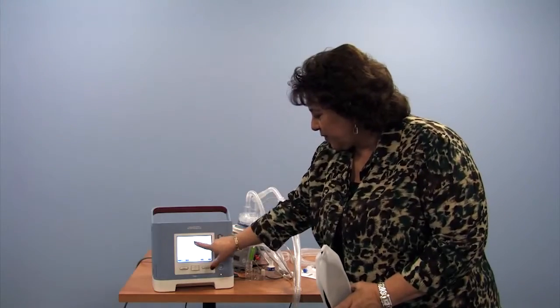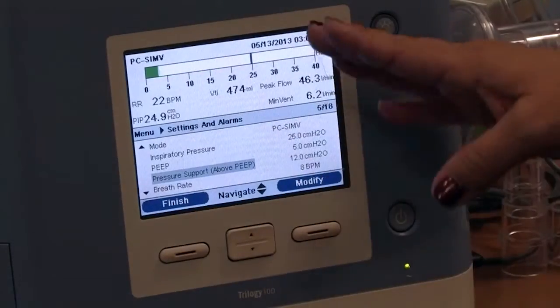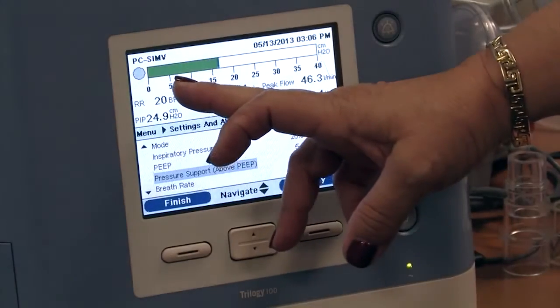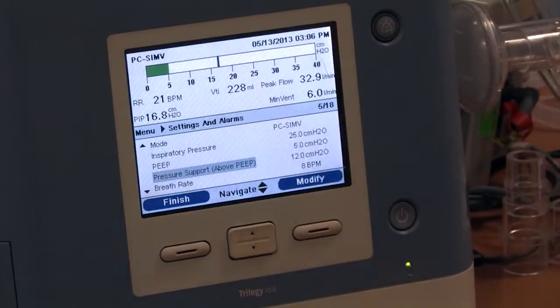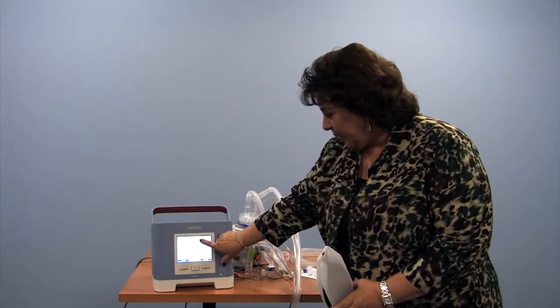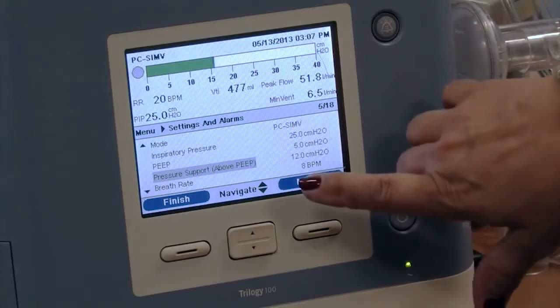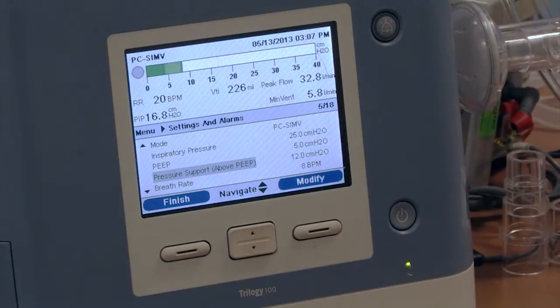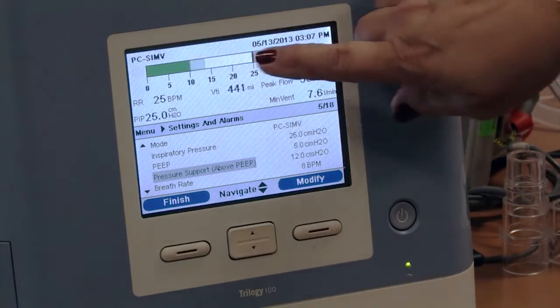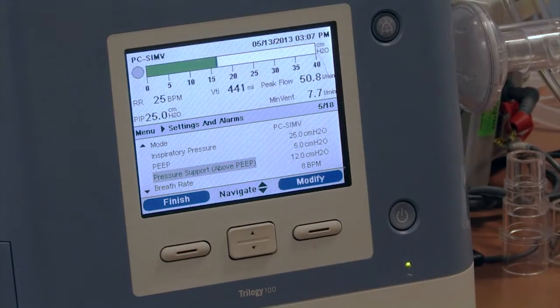Sometimes there's confusion about the language with pressure support. So this machine clearly tells you that it's 12 centimeters of water over the PEEP. We're watching this bar go up and down and show us the pressure and the baseline pressure, the PEEP, of the breath that the machine's delivering right now. You can see that the mandatory breaths, which are 8 breaths a minute for this child, when one of those synchronized IMV breaths fires, it goes up to a pressure of 25 and releases down to the PEEP of 5 as it's been asked to do.